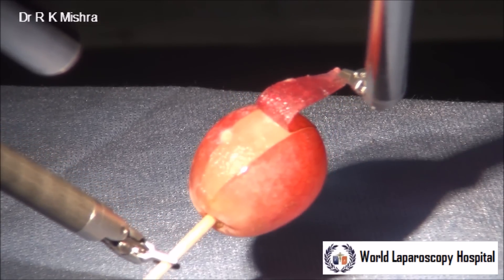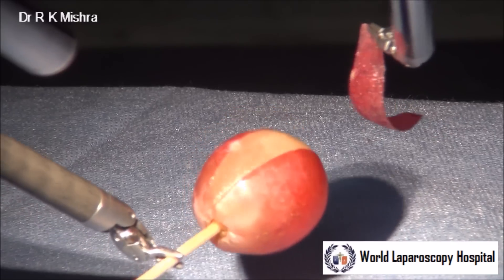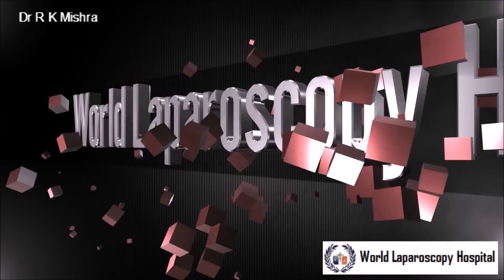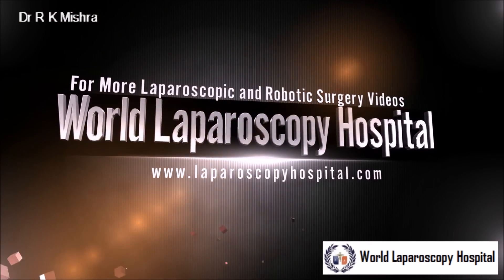This is a very good task for beginners to develop their skill. Thank you very much, and please keep on doing that on your own Da Vinci robot.